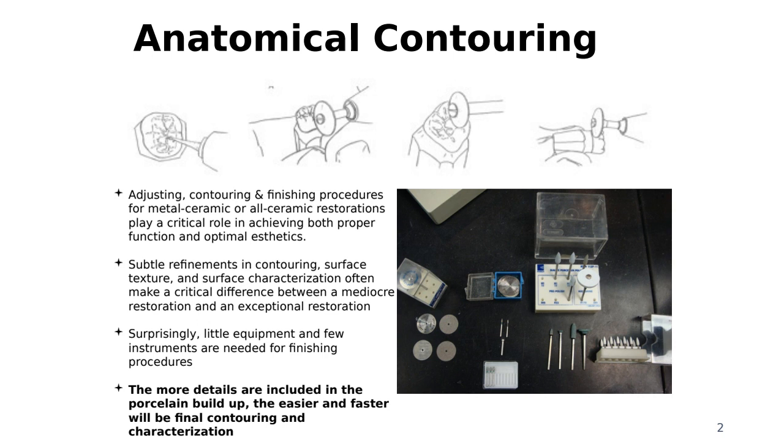And sometimes this comes with experience, you know. Many times you're going to see experienced technicians, right? When I was working in the lab, we used to buy a lot of burrs from Brazil. So our sales representative would come maybe every two to three weeks, and he would have a bag full of samples of different stones and burrs and diamond burrs, carbides, different grits, different shapes, all that fun stuff.